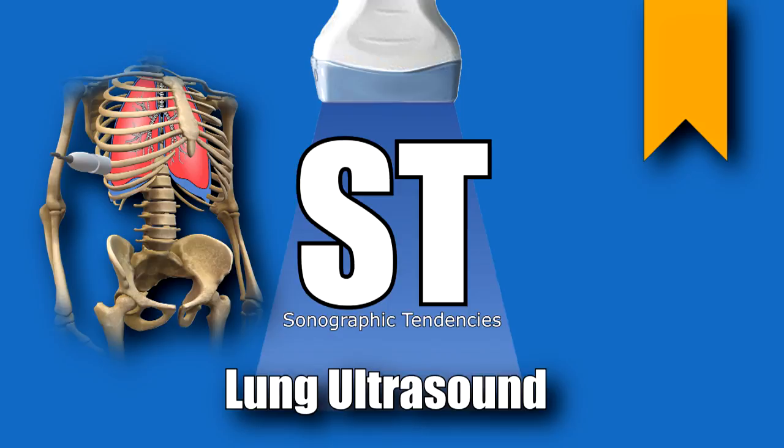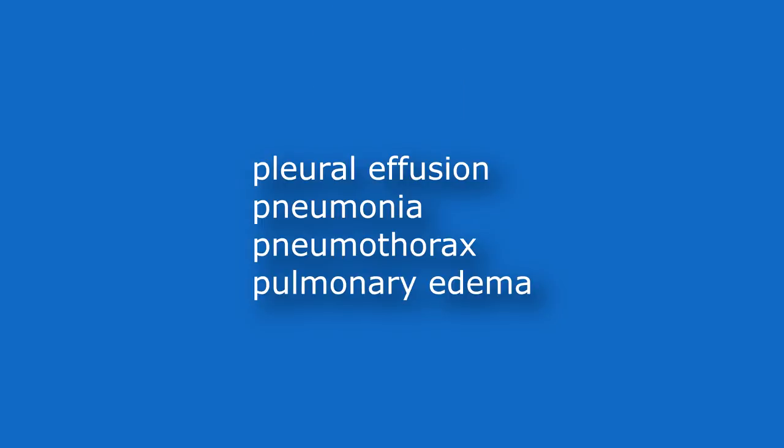Conditions we typically see with ultrasound are, very commonly, pleural effusion. It's probably the most common indication, at least where I'm at, for chest ultrasound. Pneumonia, pneumothorax, pulmonary edema. In pediatrics, diaphragmatic hernia, though that's usually diagnosed prenatally. You can sometimes scan it postnatally if they did not know.